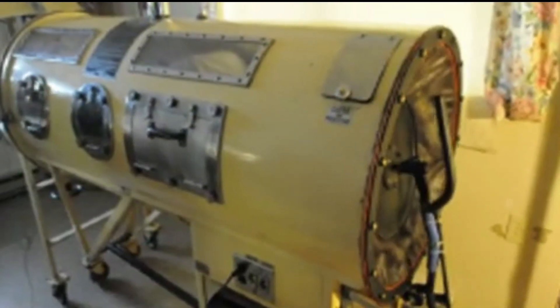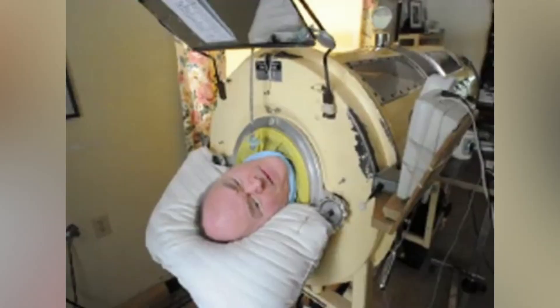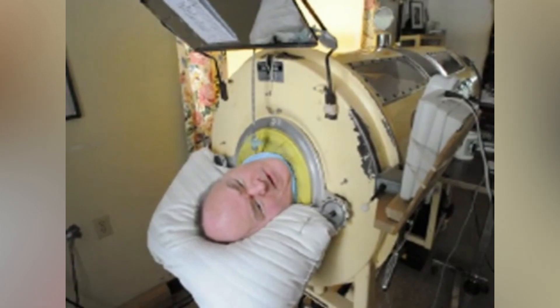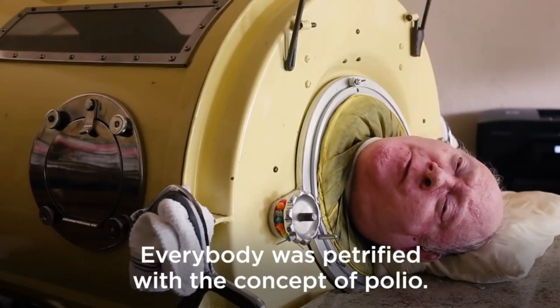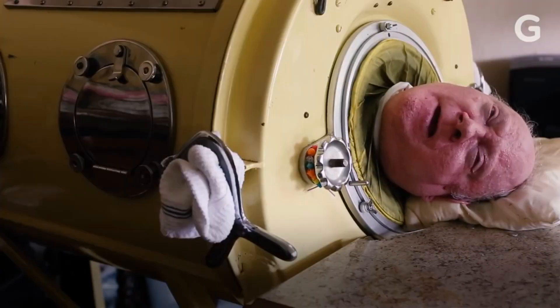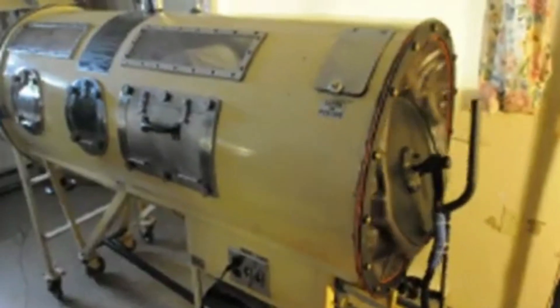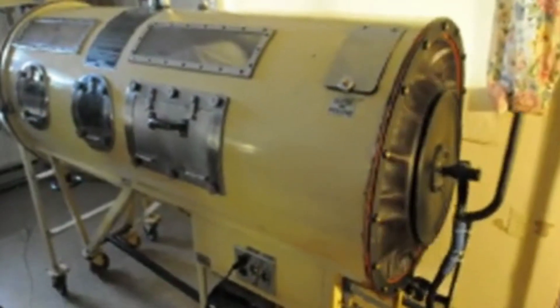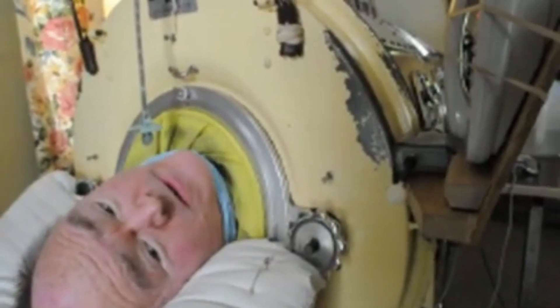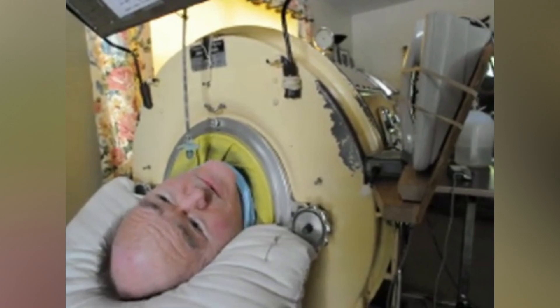So what is an iron lung? An iron lung, also known as a negative pressure ventilator, is a mechanical device used to help people breathe when their respiratory muscles are paralyzed, such as in the case of polio. It consists of a large metal cylinder or box in which the patient's body is inserted up to the neck, and a motorized pump that creates a vacuum inside the chamber, causing the patient's chest to expand and contract and allowing air to be drawn in and out of their lungs.